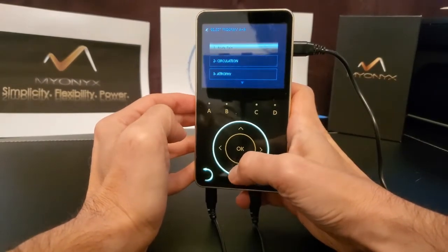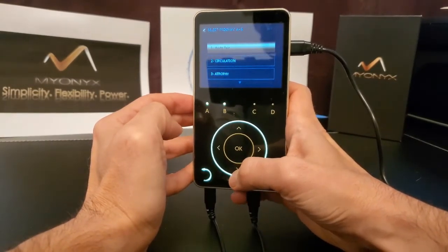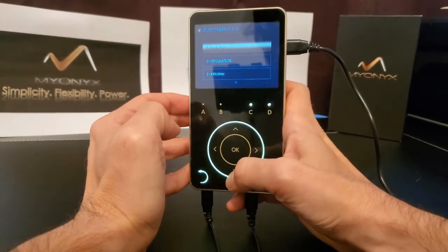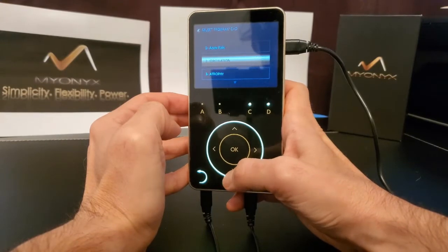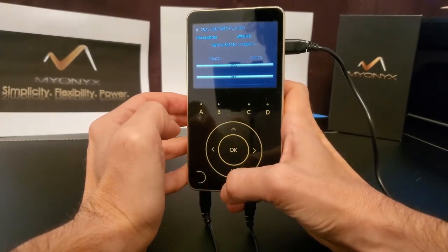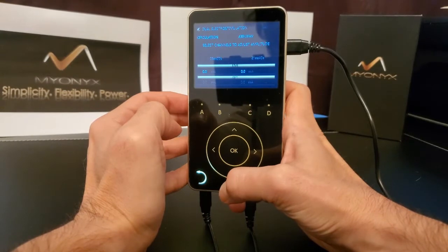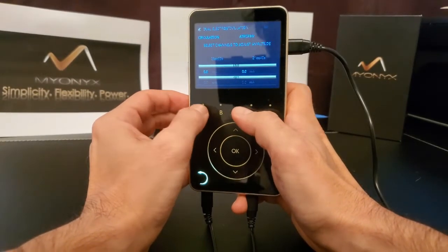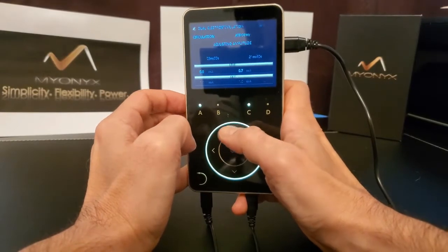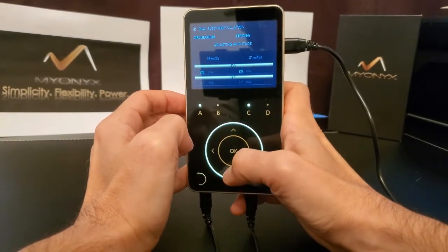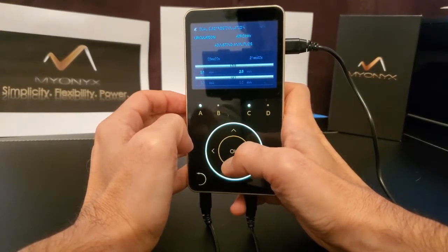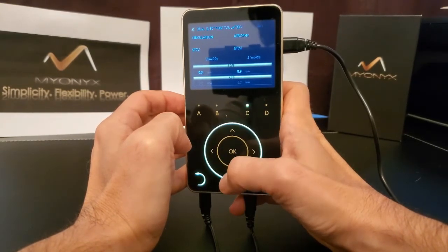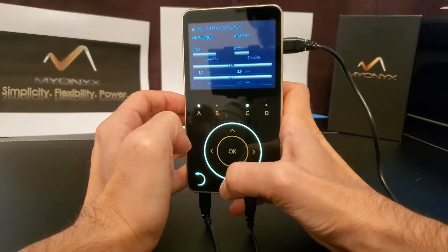Once you click them, you may now select the program for this pair. Then select the program for the other pair. On the electrostimulation screen, two separate programs will appear. After adjusting amplitudes for both programs, you may now start two programs at once. Programs will run individually.